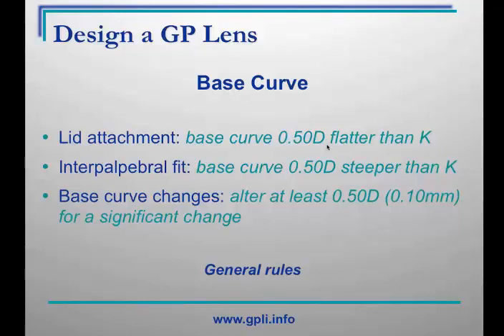Remember that base curve radius is just the starting point when you're fitting a patient. You want to find out if this lens, when it comes in, will fit well, and you can alter the lens after that. But an empirical fitting relationship will typically get you close to achieving your final fit, if not achieving the final fit on your first lens.